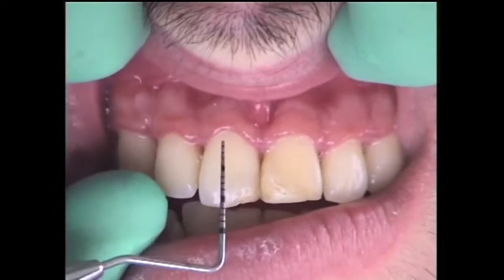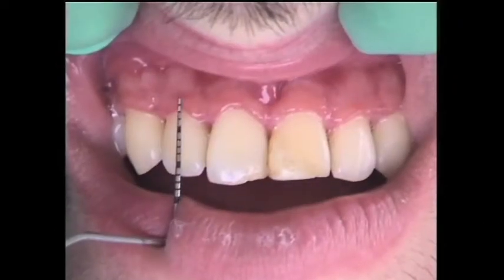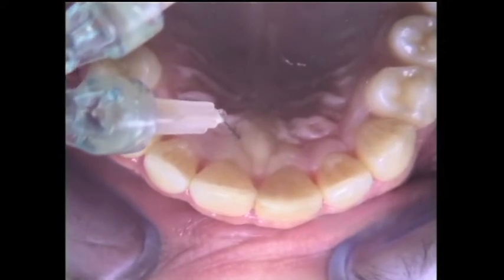Then when the patient is ready for treatment, as you can see, we're going to measure the difference between the anatomical length of the teeth on the X-ray and the clinical length of the teeth in the mouth. We have to assess the amount of keratinized gingiva, making sure we're not going to remove keratinized gingiva and create any kind of mucogingival problem in this kind of patients.